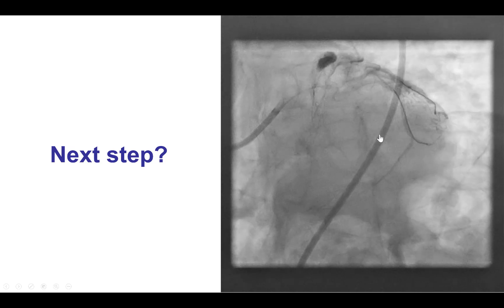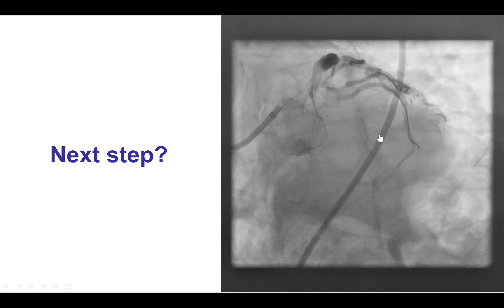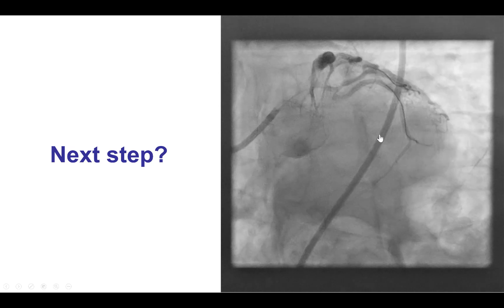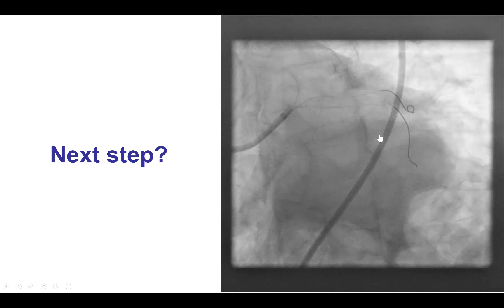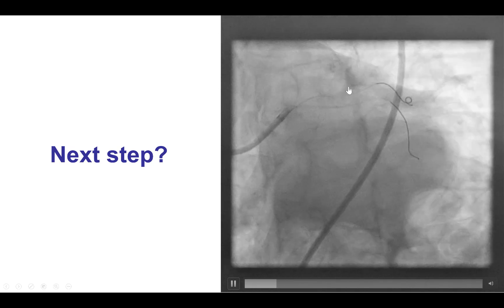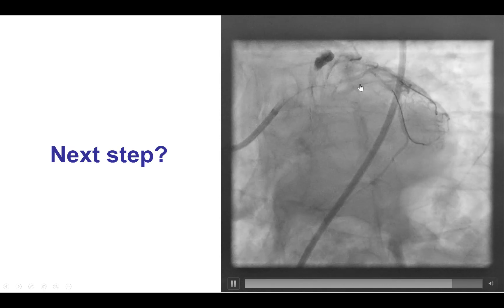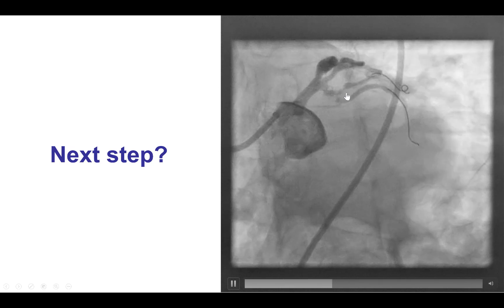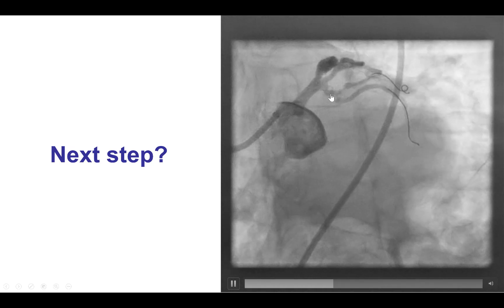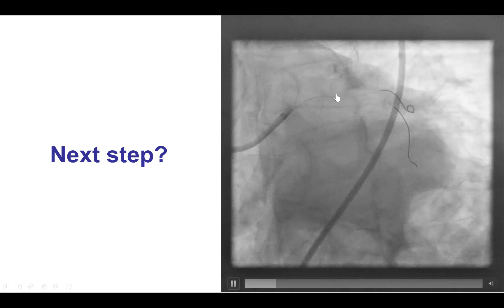This is the angiogram in a slightly different angulation than the original angiogram, and this is very useful because it changes the description of the lesion. The lesion in the obtuse marginal is not actually at the bifurcation, but slightly further down into the vessel. And there is no significant disease, apparently, in the more proximal portion of the OM1.